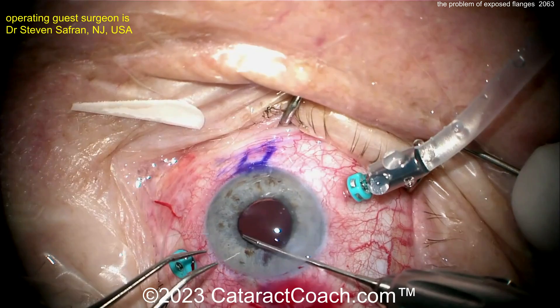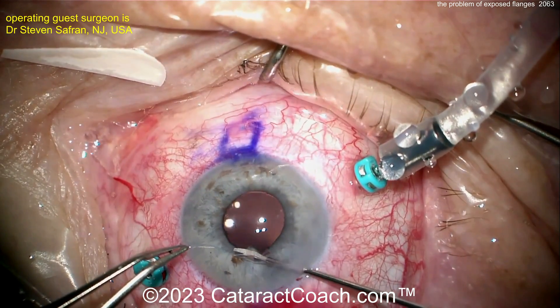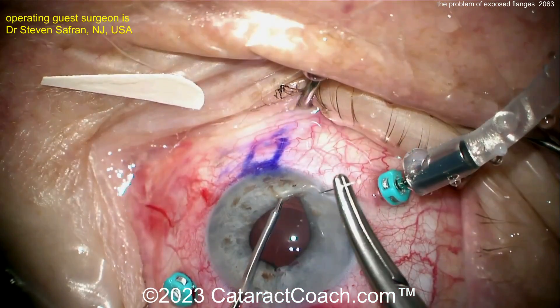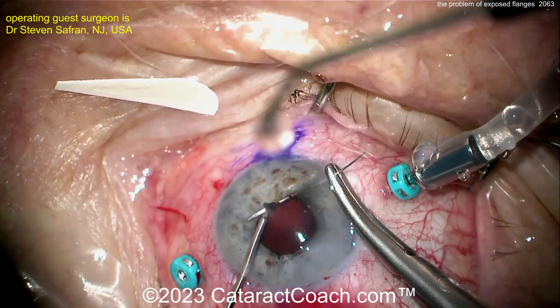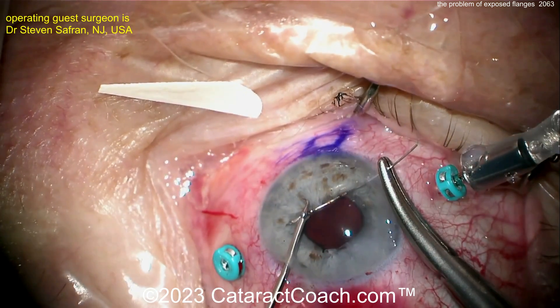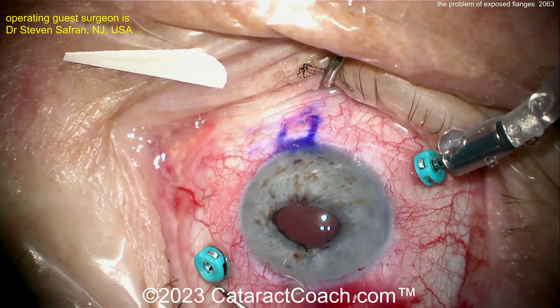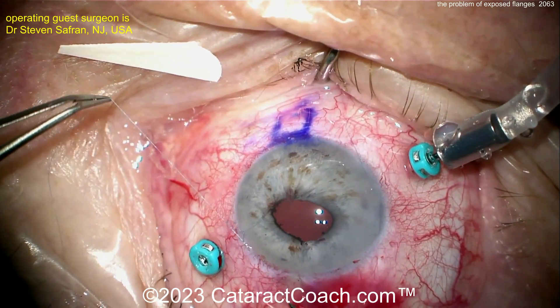Now he's doing a pupilloplasty on the area of iris atrophy to close that up — that's the patient's superior. Dr. Safran moved his chair and is now sitting superior, whereas at the beginning of the case he was sitting temporally. He's doing four rows of pupilloplasty, a little bit like a purse string — a partial hemicirclage. This is the part of the iris that was atonic, doing four or five passes through the iris margin and bringing that out, then a fourth row of pupilloplasty to carefully cinch that down. With a blue-eyed patient like this, you want to give a functional benefit by reducing glare, and also a good cosmetic effect because it's such a visible iris compared to a brown one at conversation distance.